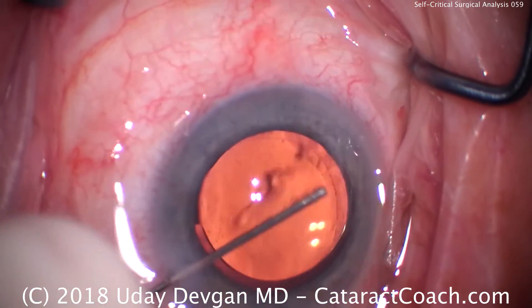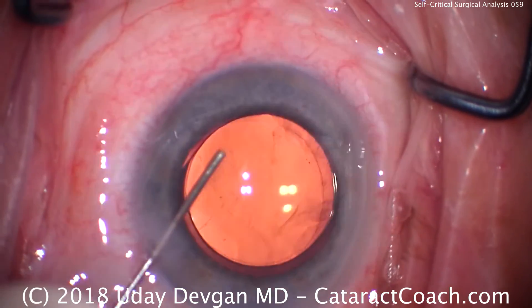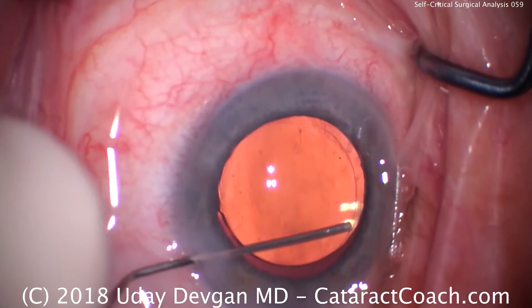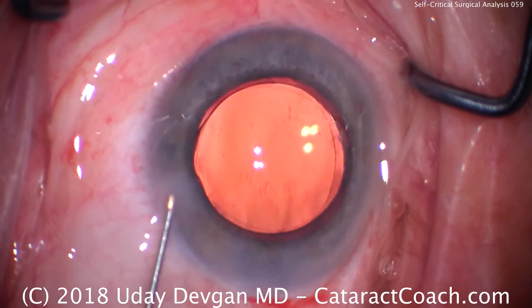Look — retained viscoelastic in the eye. I'm glad I'm squirting it out at the end. So maybe we could have done a better job with removal of viscoelastic using the IA probe. Practice this. Be your own toughest critic. Thank you.